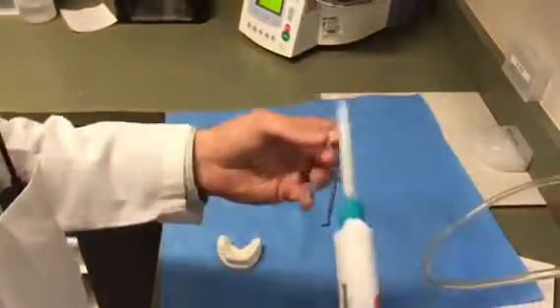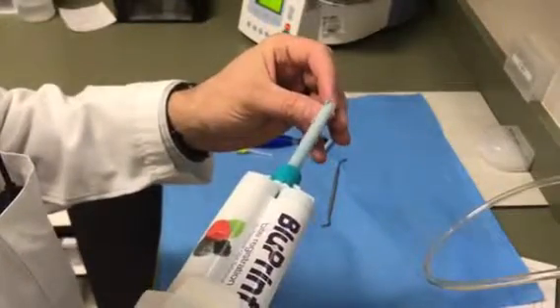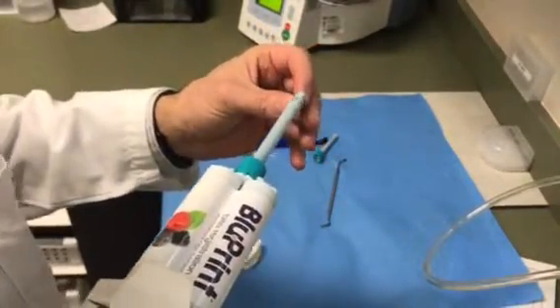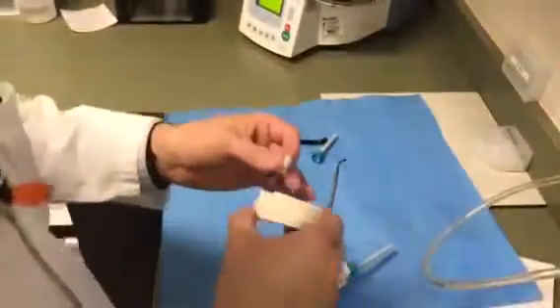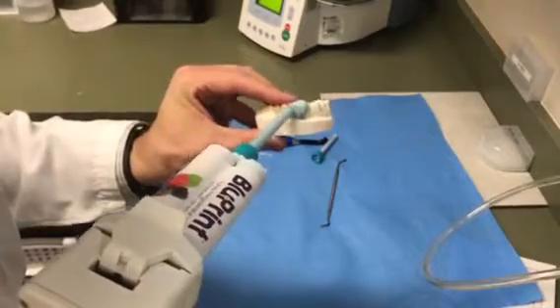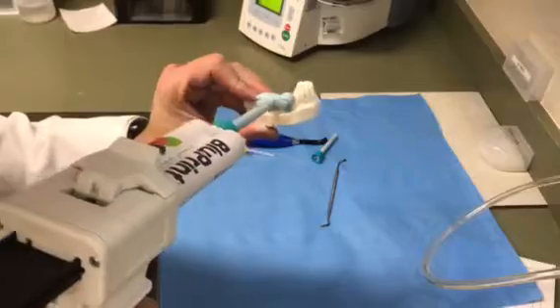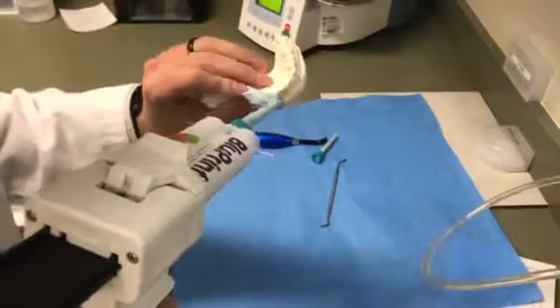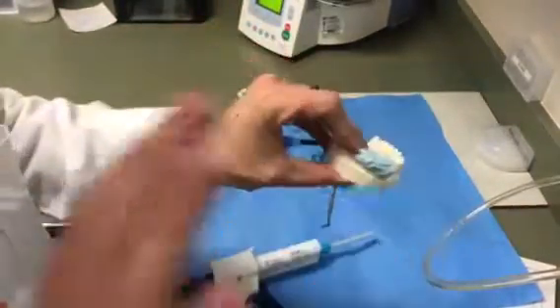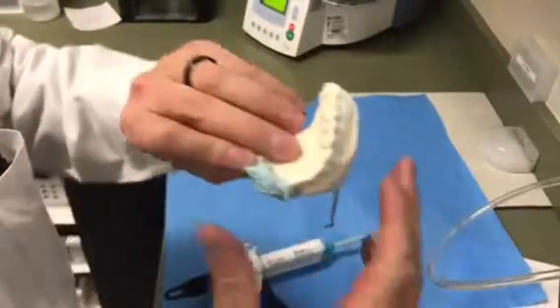And so all I do is I take my bite registration material, and if the contact is an issue, I'll start it there. And you make sure to work in between, but then I almost give myself a little impression of the whole situation. At least on one half of it. Sometimes I go both, but usually it's on one half, so then set the bridge into that, see the discrepancy, and take it out.